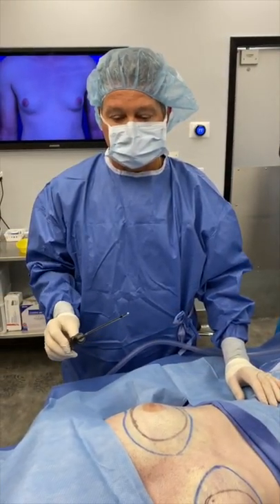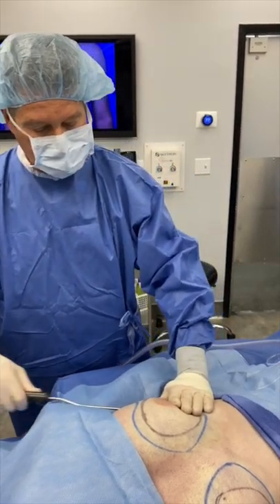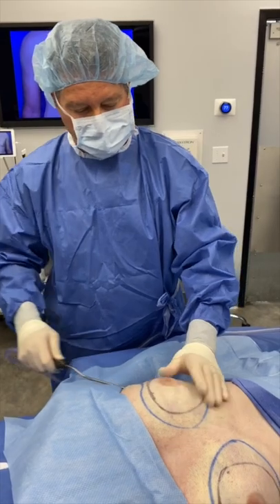Step 3 is the use of traditional vacuum-assisted liposuction to remove the effluents resulting from the VASER treatment.